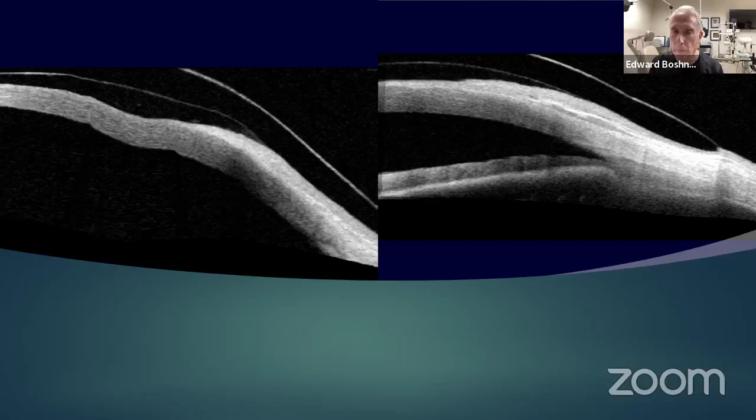People from all over who are interested in scleral lens technology come. And scleral lens technology is really growing in leaps and bounds. It's the fastest growing, the most interesting technology. Everyone wants to get involved with scleral lenses, and how it can change someone's life is unbelievable. It can take someone who's severely depressed and thinking of suicide and make them a functional human being once again.